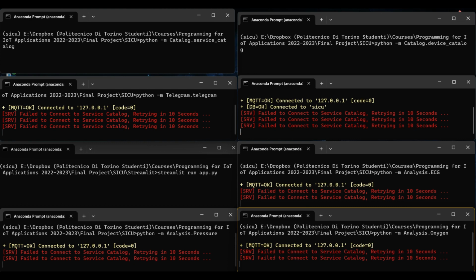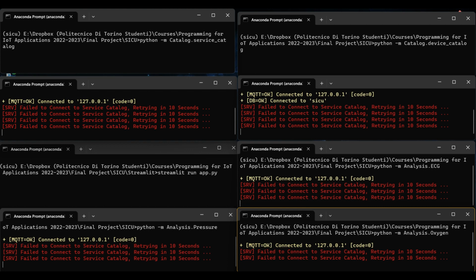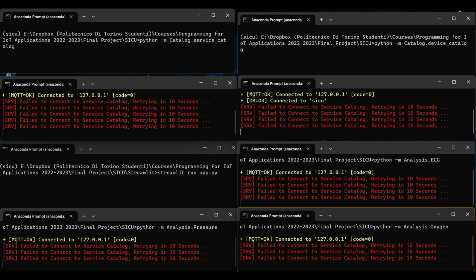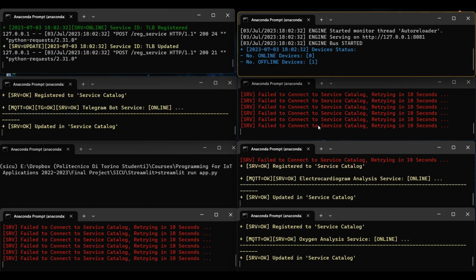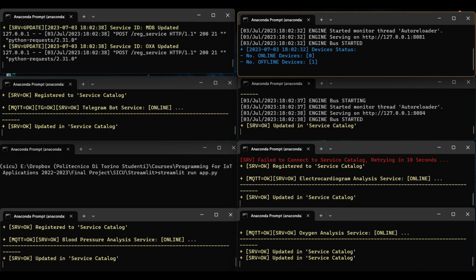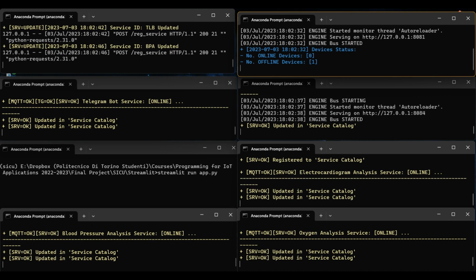I should note that each microservice has unique configuration and setting files that you can find in the subdirectories, and you can modify them before running each microservice. It's important to check the settings first and set the desired setting values and configurations, and then run the microservice itself. So by running the service and device catalog, microservices can now see and communicate with the service catalog, and they can register their information and endpoints into the service registry system. This information will be regularly updated in the service registry system.